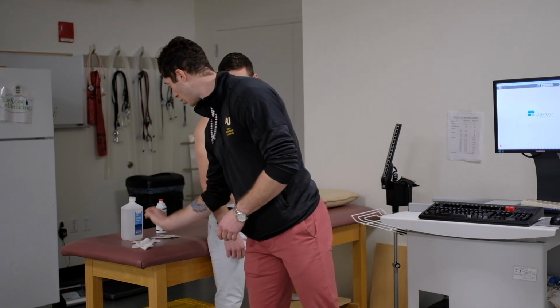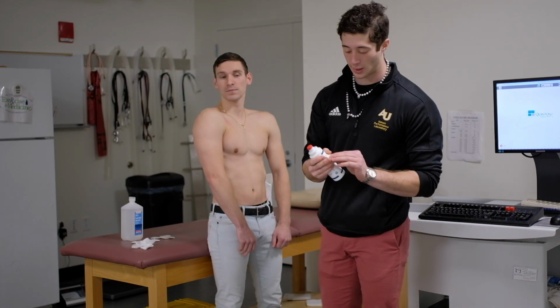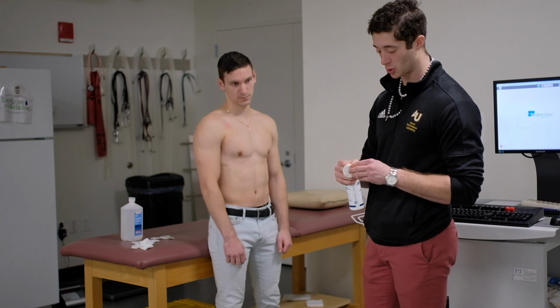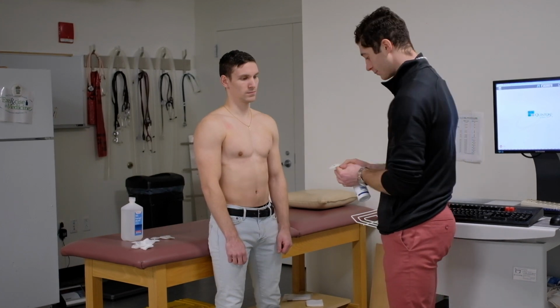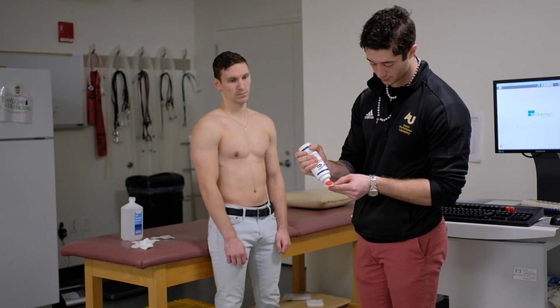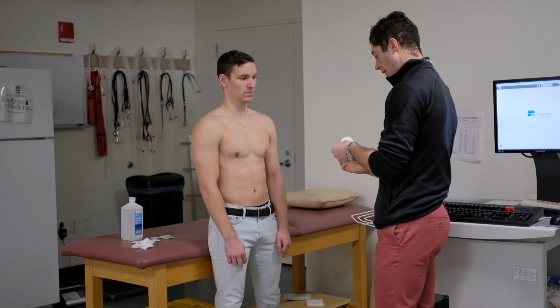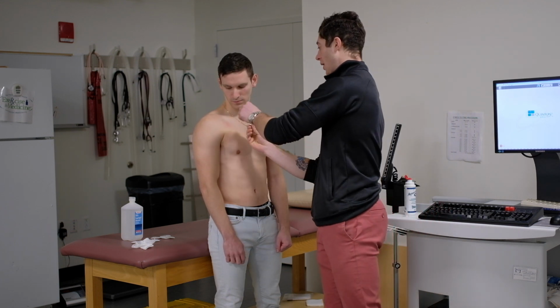After that's done, you can then take an electrode and the ultrasound gel and apply the ultrasound gel to the electrode backing. You only have to apply a little bit, and then go ahead and place the electrode on the spot that you wiped down.